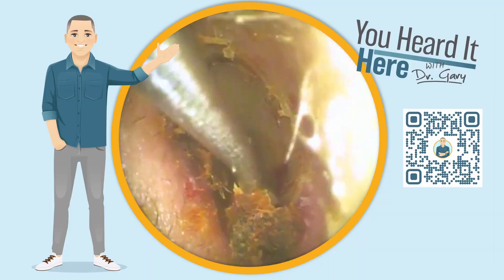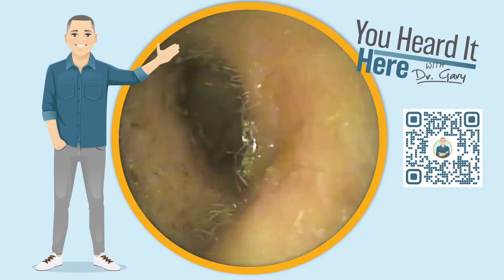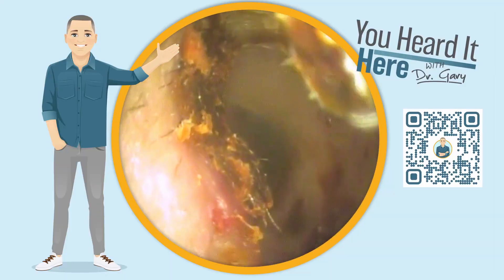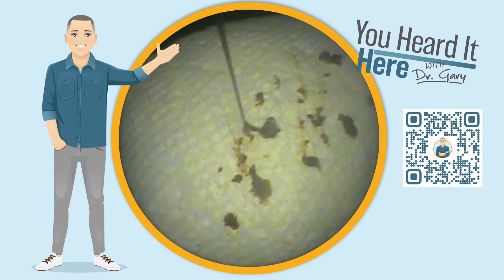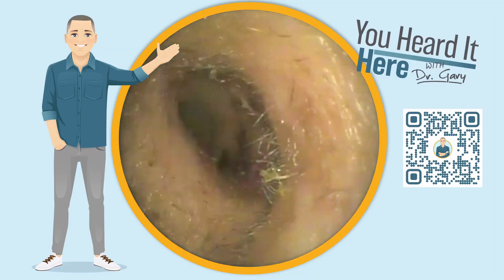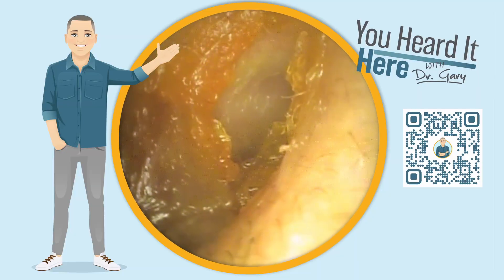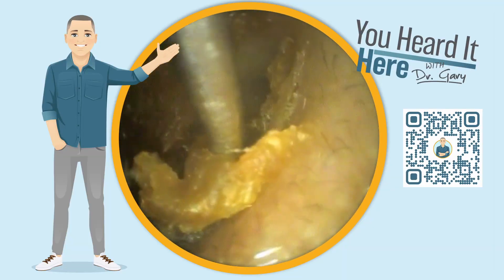We're almost there — we're going to go back in one more time with the curette to get this all out. Let me know in the comments if you like these shorter videos or want to see more long-form videos. Unfortunately, viewers tend to watch about the first two to two-and-a-half minutes and then abandon the video, so making videos five to seven minutes long doesn't really help — it just gives you more commercials to sit through.